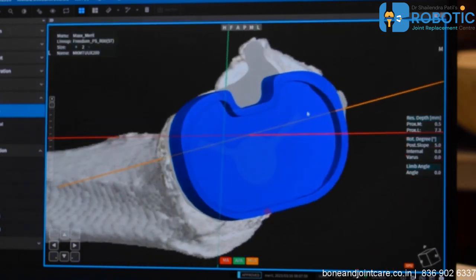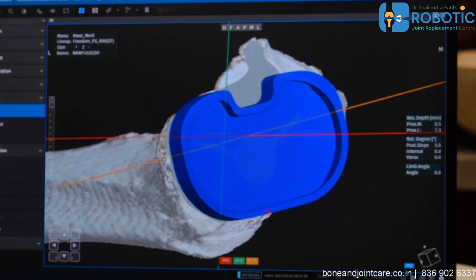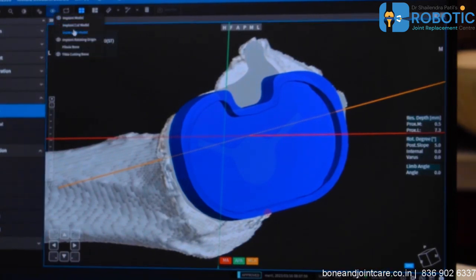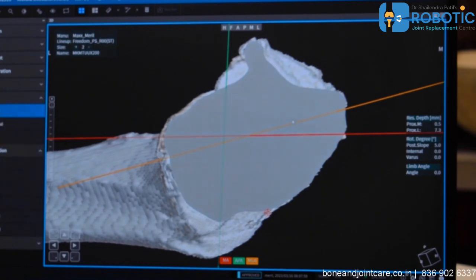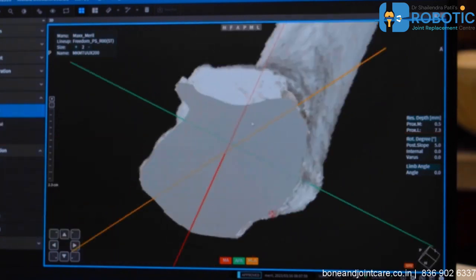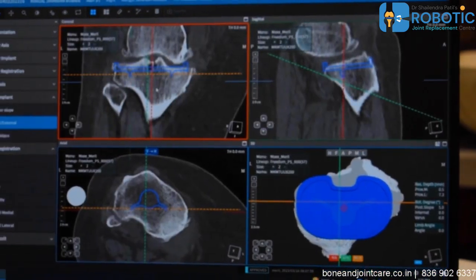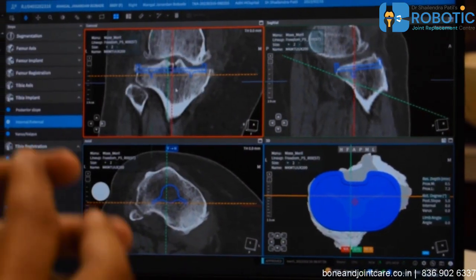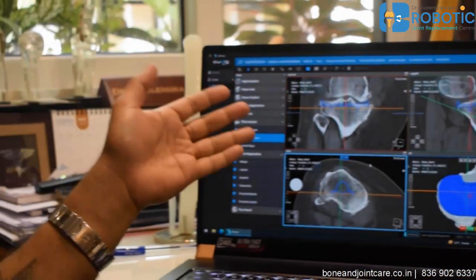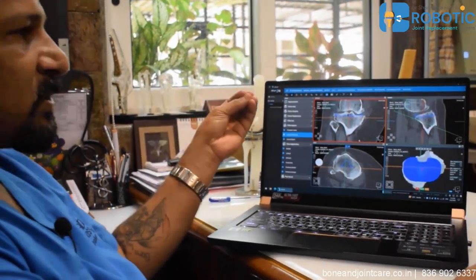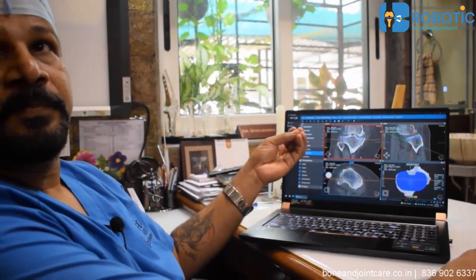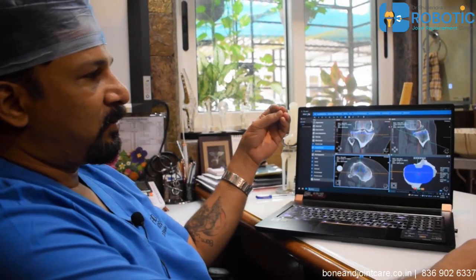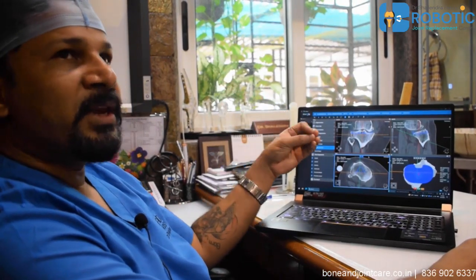I can even go one step further — take out the implant and see how the cuts are going to look. All of this gives the surgeon a free hand to provide what the patient's body is demanding and to place the implant in the best position as per the bony landmarks.